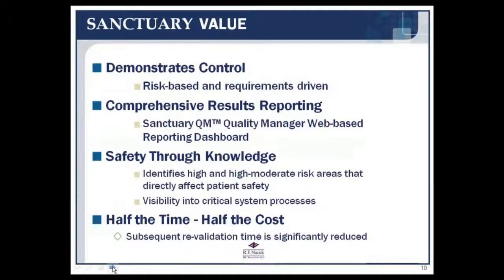Sanctuary value. Like all validation and all change control policies, it demonstrates control. It demonstrates that the lab has control of their software system and their medical device. Comprehensive results reporting. You'll see the Quality Manager where you can look up any result anytime. Safety through knowledge. If everybody who's working on the system understands that the system is working, if the medical director understands, the transfusion managers understand, then everybody can have a better feeling of confidence in the tools that they're using.